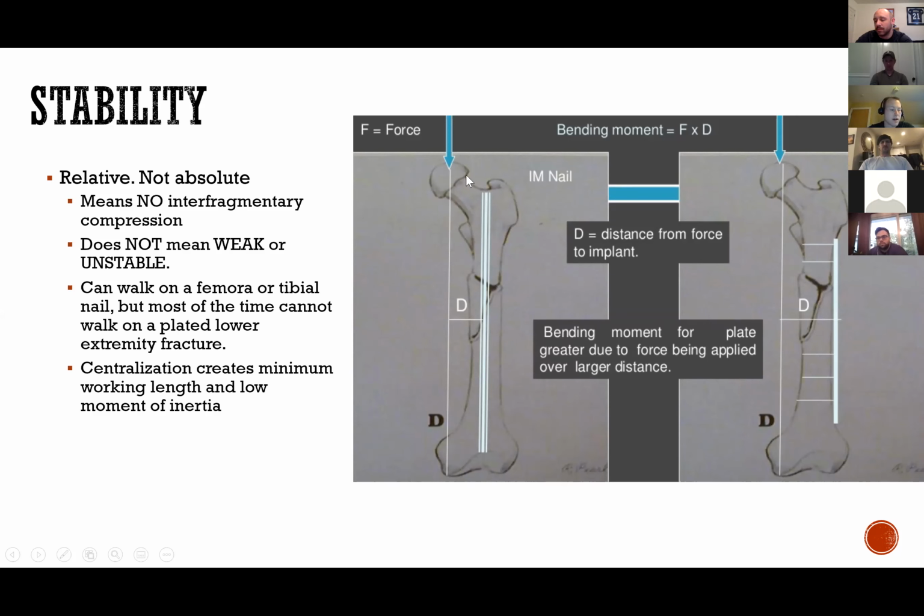I think I have something demonstrating that where you're instrumenting, where you're cutting this patient is all up here. For a hip, for instance, or for a femoral shaft, you're cutting the skin above the trochanter. You're putting a soft tissue protector down through here, through the gluteus, and then you're drilling a hole in the bone here. You're never going anywhere near this fracture. All of the muscular attachments here are preserved, and the only damage to the muscles here is the damage that was already done by the fracture. And then you're putting in cross-lock bolts down here. So you're going for a different goal.